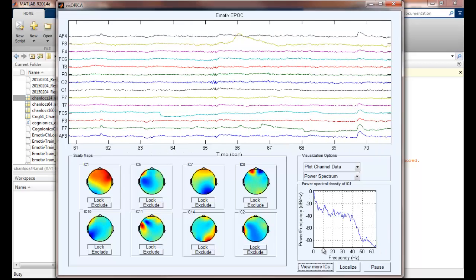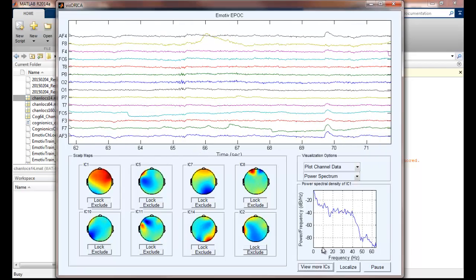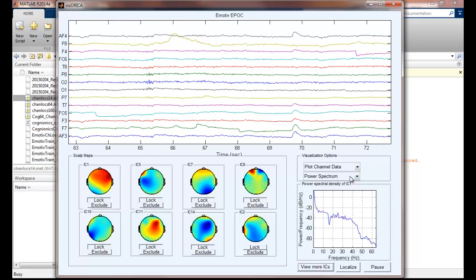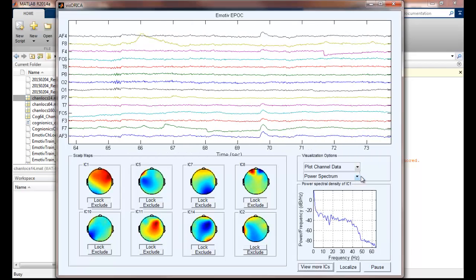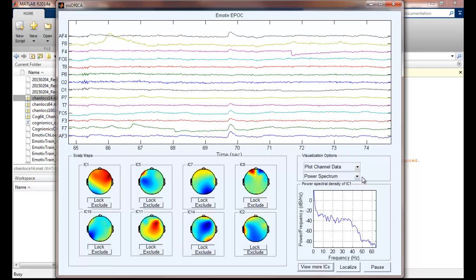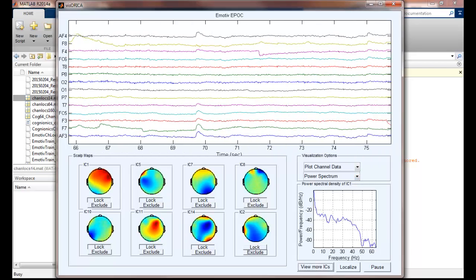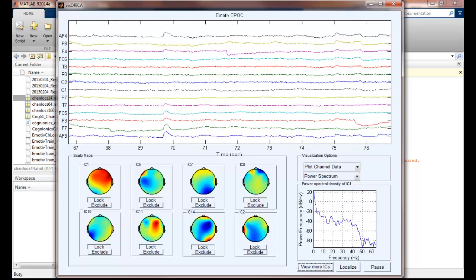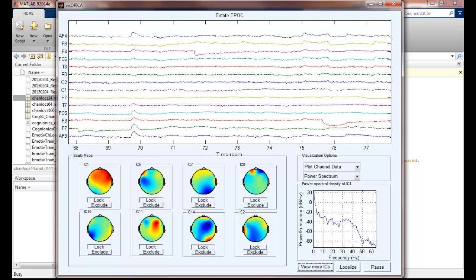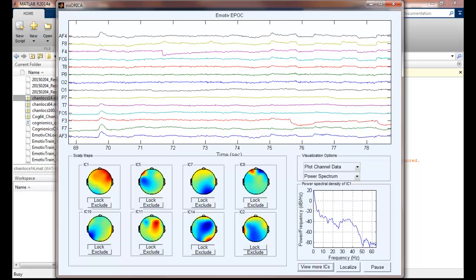So these are the basic features of the interface, which provide a source-level functional EEG imaging in real-time so that we can monitor and track the brain functionality.